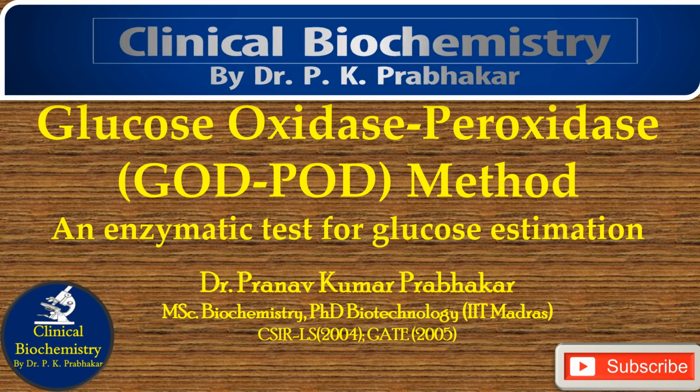Today I am going to talk about the glucose estimation method. There are different methods for glucose estimation. We have the Folin-Wu method, which is one of the oldest methods. It is not a glucose estimation method, it is the estimation of a reducing sugar. Then we have the orthotoluidine method, where we measure the aldehyde groups, aldehyde compounds. And the third method is the currently used one, one of the best methods, called the glucose oxidase and peroxidase method, or in short form the GOD POD method. This is an enzymatic method for glucose estimation.